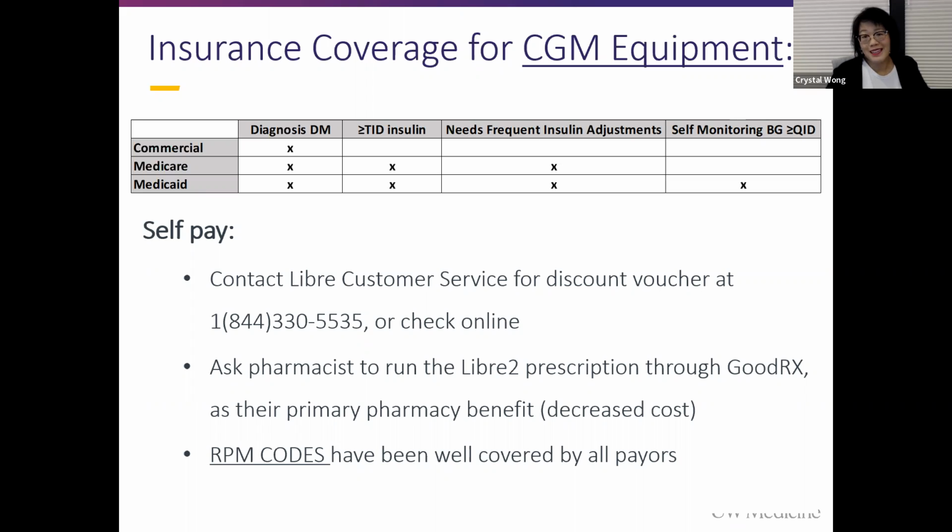I would say that it's coming, but it is FDA approved for that. And if you look at the ADA website, they have some information about self-monitoring. Basically, they have a very, I don't want to say relaxed stance, a very to-be-interpreted stance, basically saying if the patient is willing to engage in self-monitoring, this will help them make good lifestyle decisions, then they're for it, basically. But there's a clearer evidence base for use in insulin.